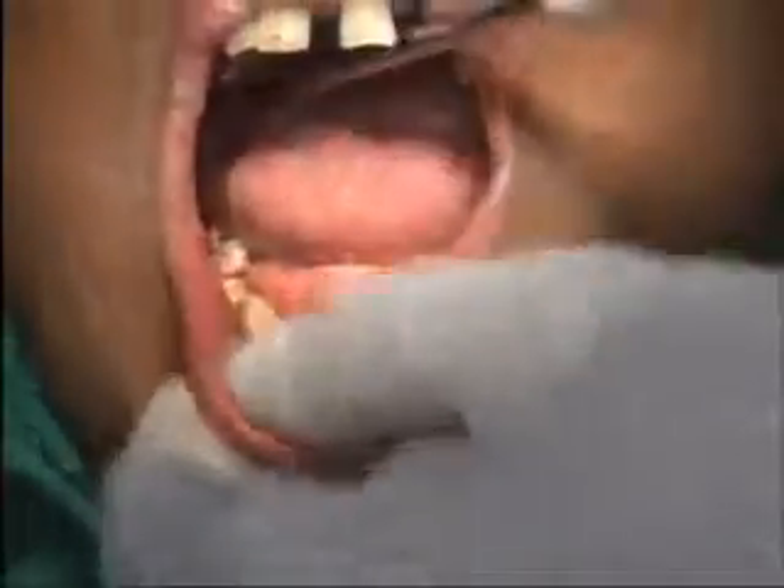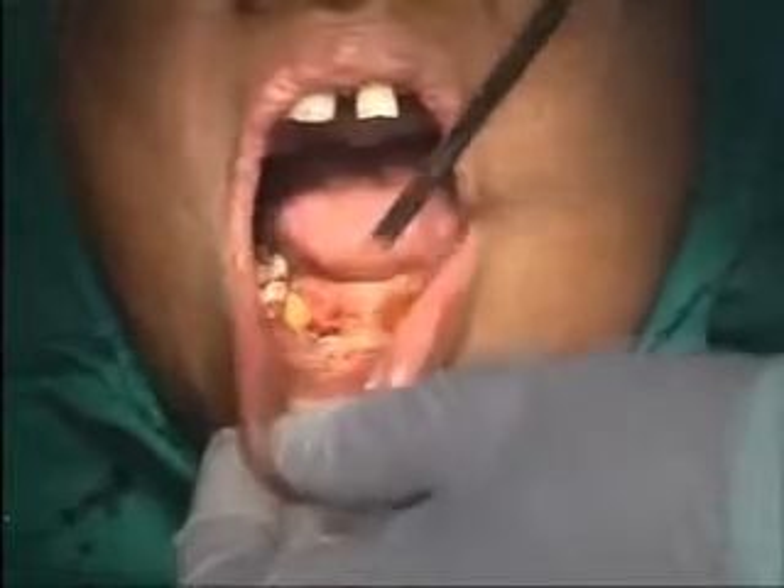Give me 3.5x14. Sir Vicky, please give me 2 implants of 3.5x14.